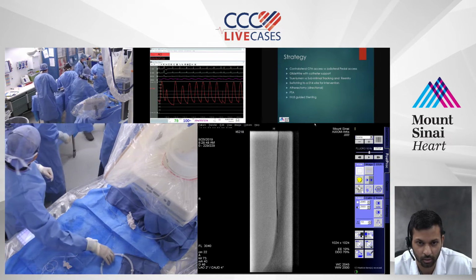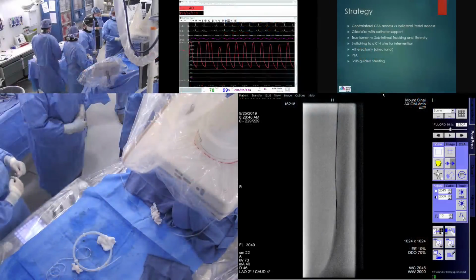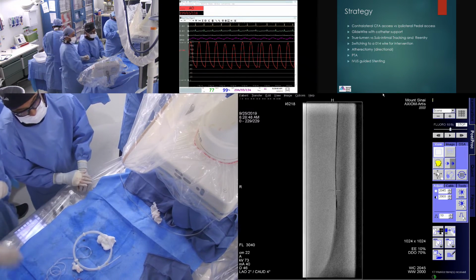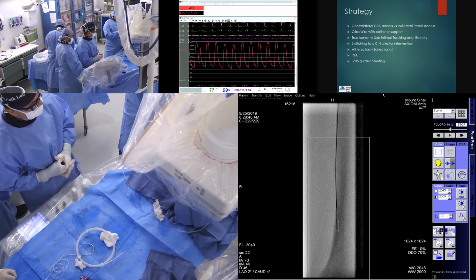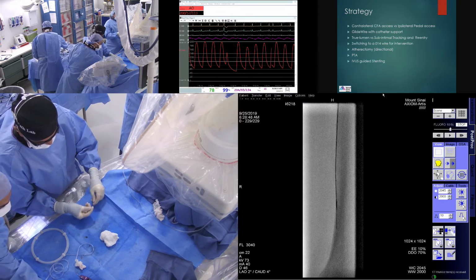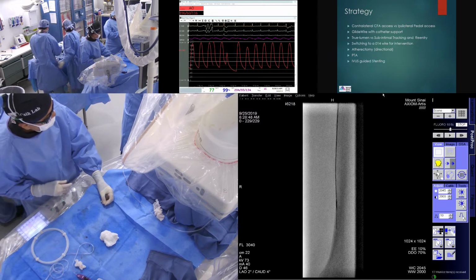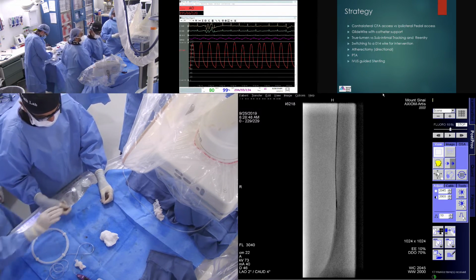Yeah, I agree, because I think what happened was they probably angioplastied the areas where you could have bypassed to in the future, like where I am right now. I think this is an area where we know the artery is, there's no healthy artery in a diseased artery, but a relatively healthy artery compared to an occluded artery, where you would bypass. So unless I embolize or dissect, and people talk about this all the time, I'm not going to make this person worse. How can I make them worse?